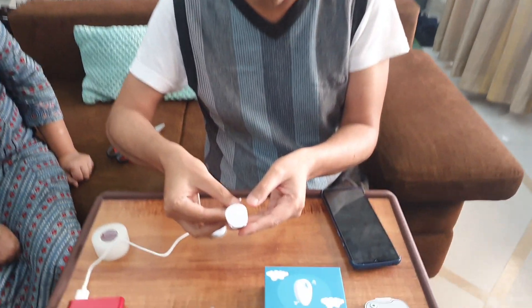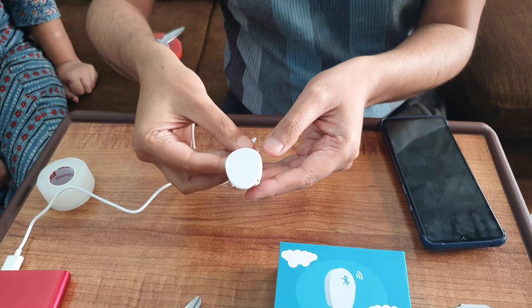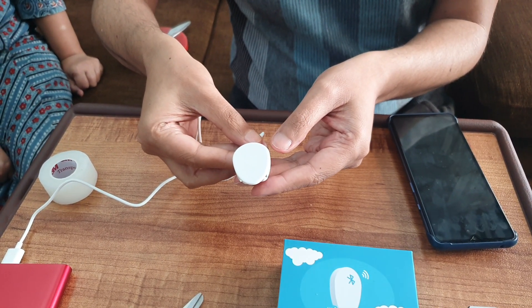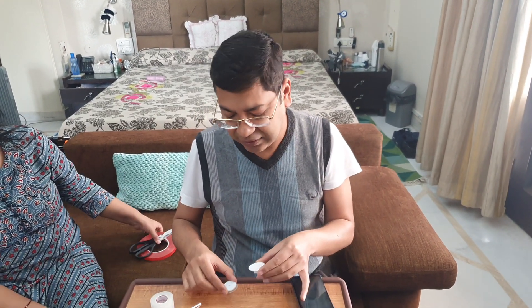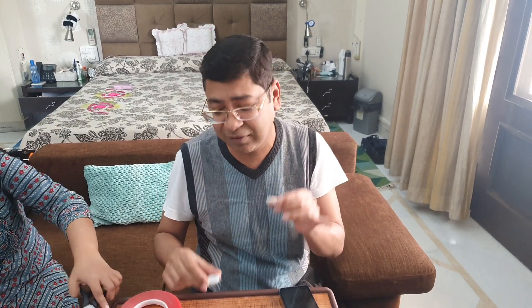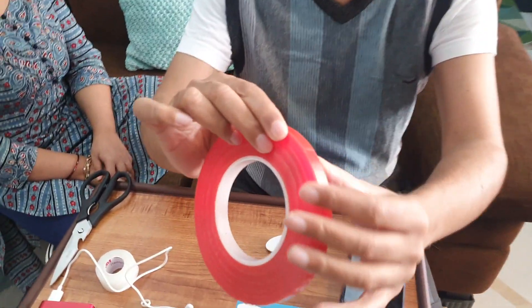Once it is fully charged, the light turns to a solid blue. I have fully charged it, so it is ready. To stick it to your arm and to the sensor, you need a double-sided tape — you can buy it off Amazon. It is a very simple, thin tape, around one centimeter wide.